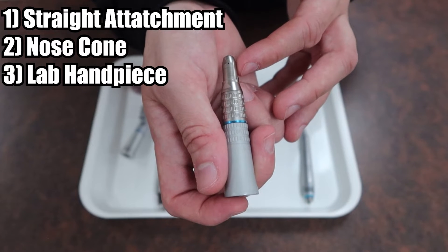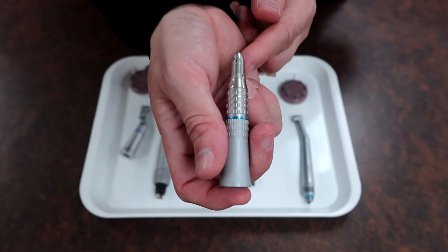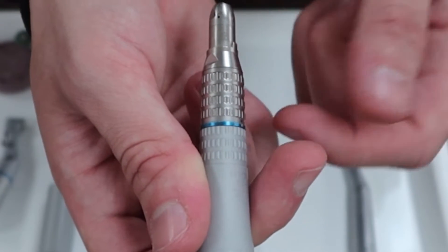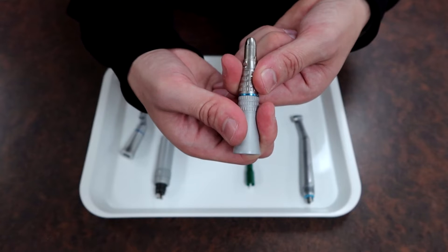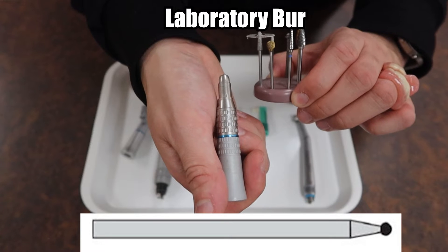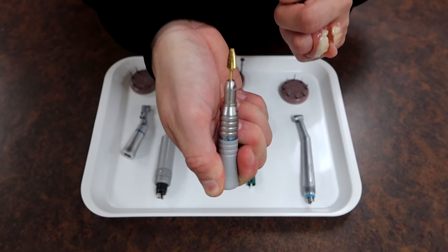The other attachment is going to be known by a couple of names: a straight attachment, a nose cone, or a laboratory attachment. These all feed onto our slow speed motor just like the previous attachment. With the nose cone, inserting a bur is different from the latch type. You pinch above and below a ring or separating portion and give it a firm twist until it unlocks and opens. Then slip any appropriate bur — such as a laboratory bur — through the top, letting it fall all the way down, and reverse the twist to lock it up.